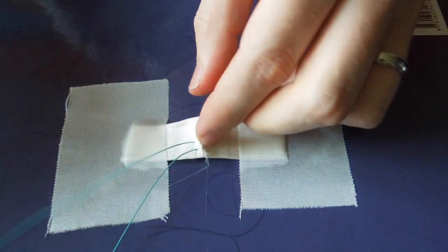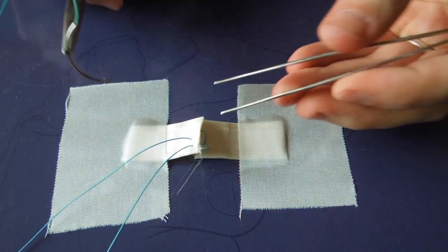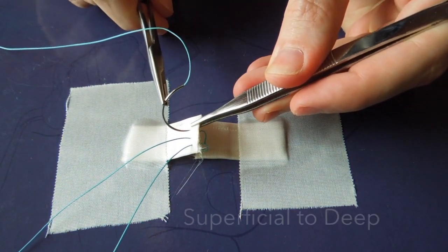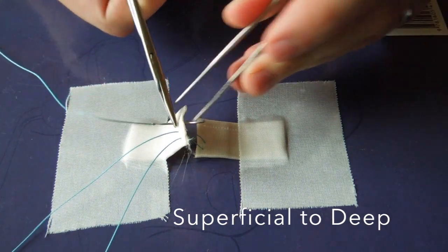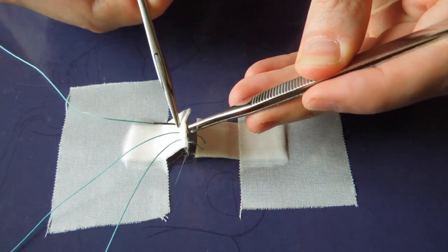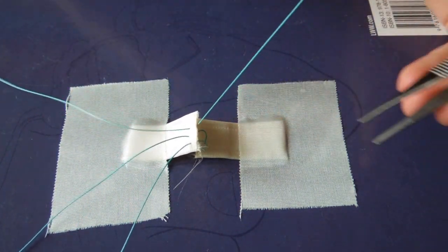This is commonly used for repairs of the plantar plate if you're doing a direct plantar approach. It's also used for Brostrom and Brostrom-Gould for ATFL repair, and it's also used for repair of the superior peroneal retinaculum.